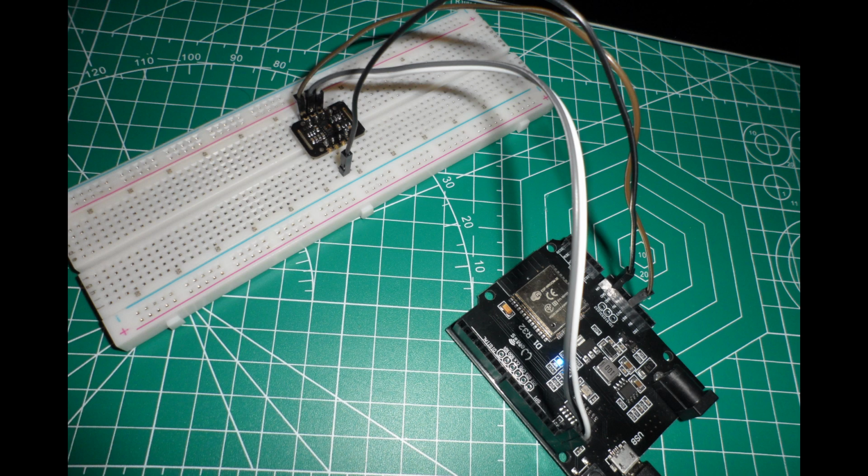Now, I've soldered the voltage select to use 3.3 volts as mentioned, along with headers so I can mount the module on a protoboard and connect jumper wires to my ESP32. I've connected the I2C interface from the MAX30102 board to the dedicated I2C I/O on the ESP32, along with the 3.3 volt supply and ground. We only need to connect these four pins for the device to work, and we will be printing out results to our PC running a serial monitor via the serial USB interface between the ESP32 and the PC.